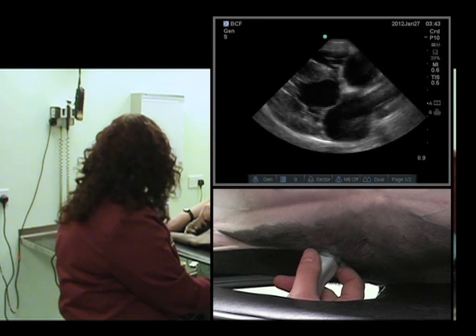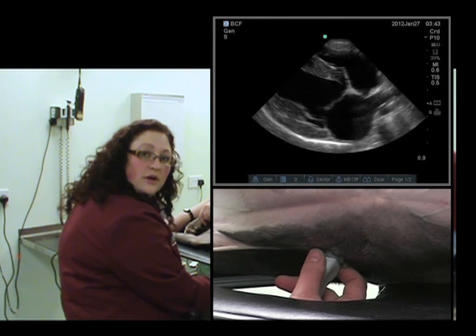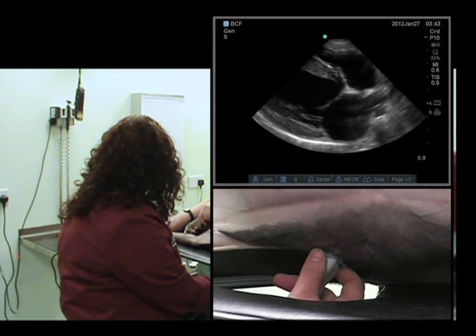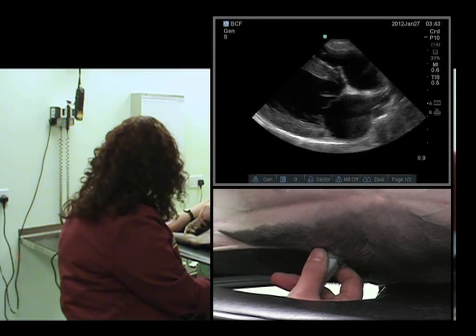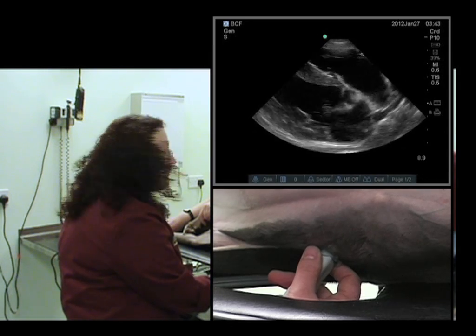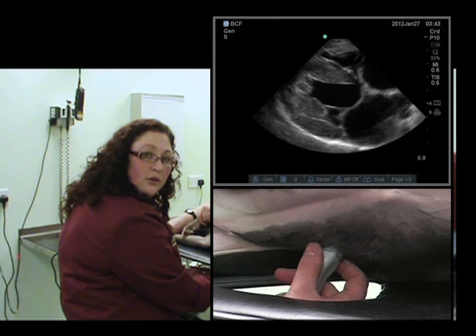It's looking pretty good. However, we don't have a really crisp view of the left ventricle, so we'll need to make a few small adjustments. I'll rotate the probe anti-clockwise, just ever so slightly, always keeping an eye on the image to see exactly how it's looking. That's much better. If you're losing a bit of the left ventricle off the left side of the screen, you can either move an intercostal space cranially, or slide the probe down towards the sternum a little bit more ventrally.